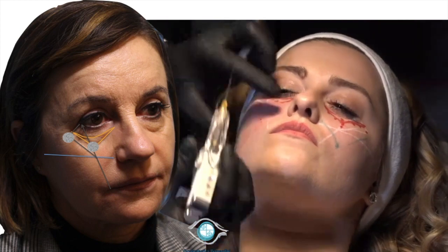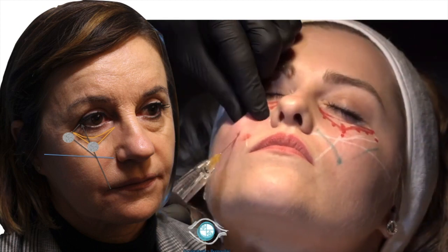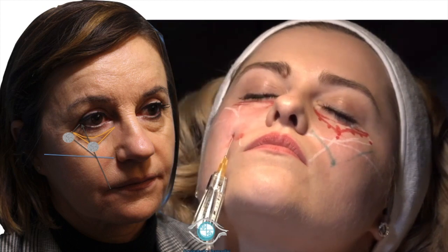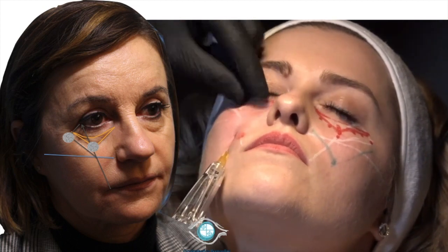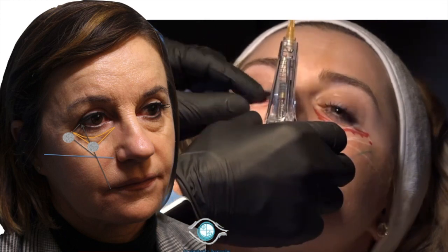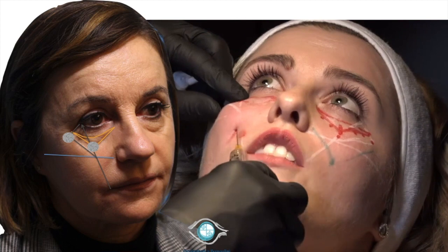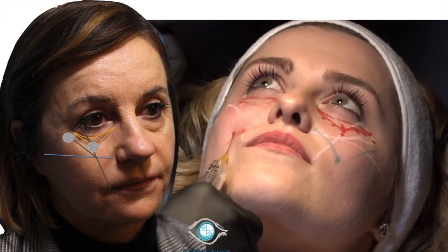And we go down then centrally to determine central support, right at where the main defect of the infra-orbital hollow is, which is the apex of the V deformity. Here, below the orbital rim, we deliver another macro bolus of 0.1 cc of high G' filler, and again nearby to the left and to the right to smooth the transition.